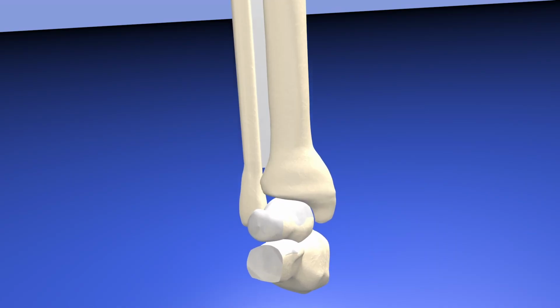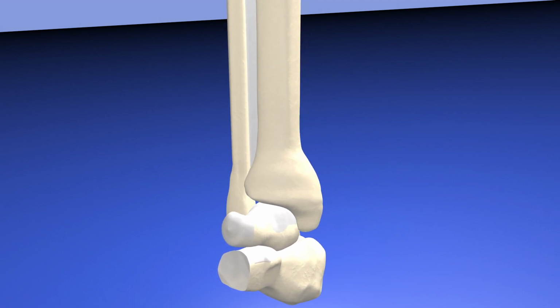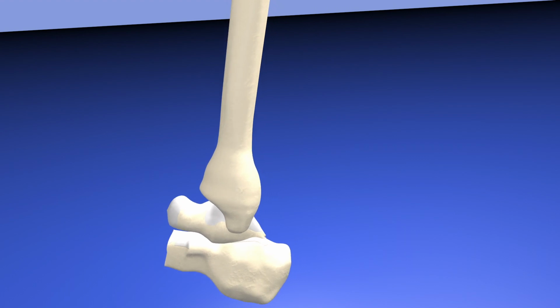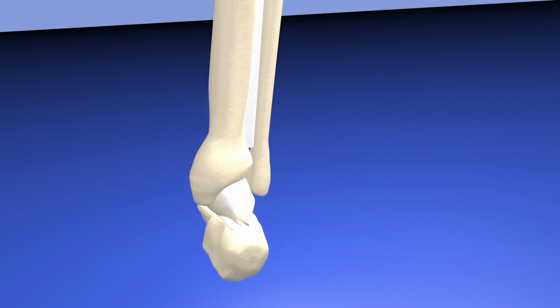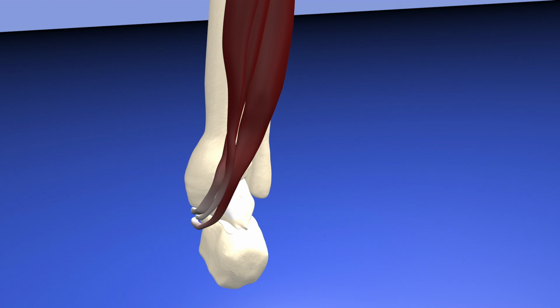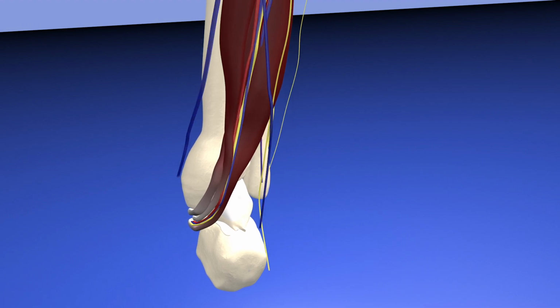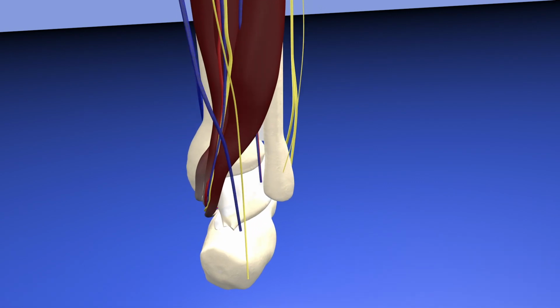Here we're going to review some of the anatomy involved in this case. Here, essentially just looking at the bones with the interosseous membrane. On this demonstration, we're just going to focus on the posterior aspect of the leg, specifically around the Achilles tendon. Now we'll bring in some of the deep musculature into view. You can see the flexor hallucis longus, tibialis posterior, flexor digitorum longus going from a lateral to medial direction.